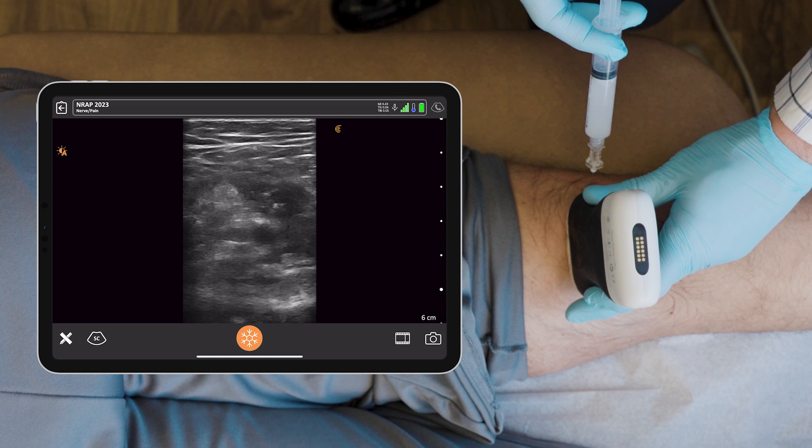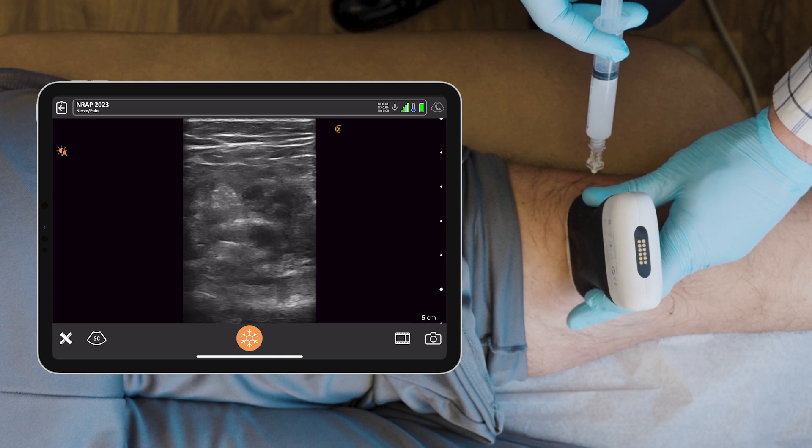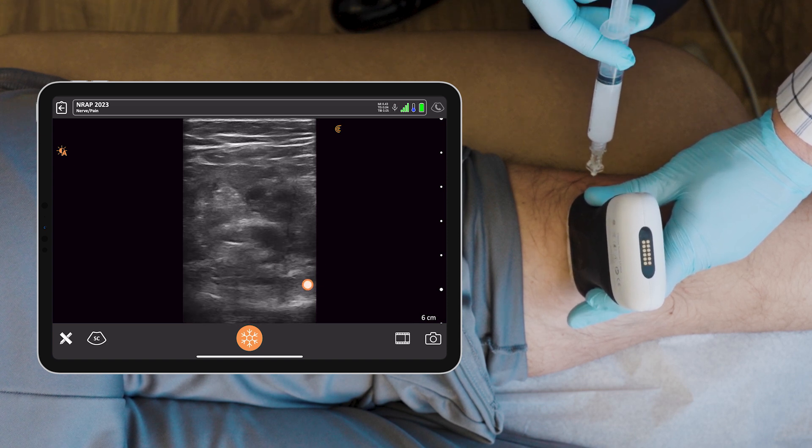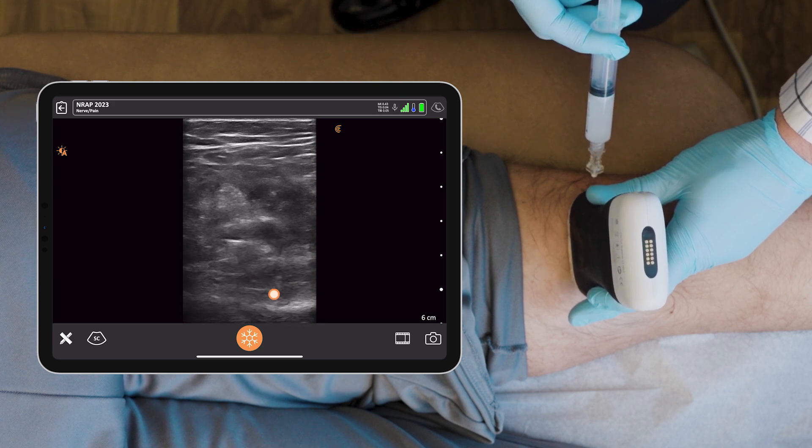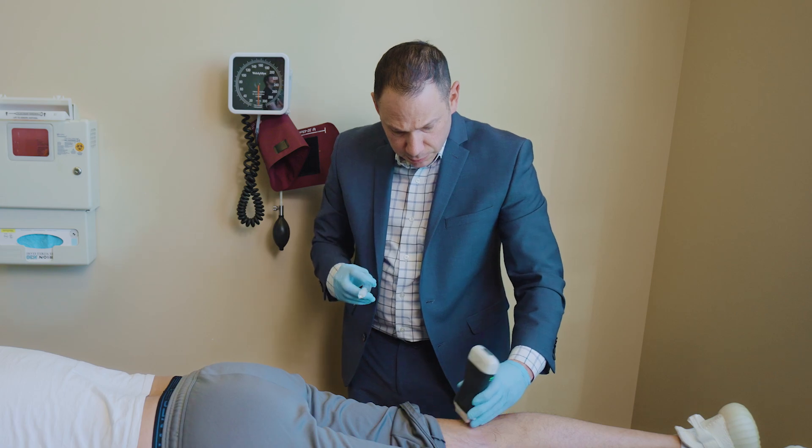And then needle deep to the popliteal artery, bottom right corner of the screen. And you see the fluid spreading. And I'm taking the needle out.